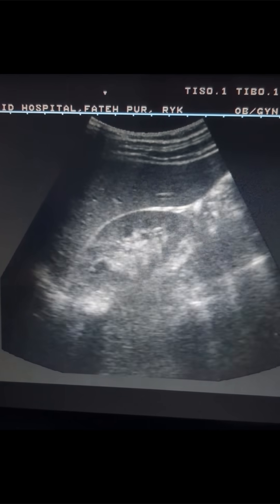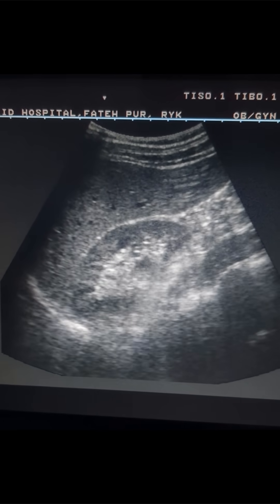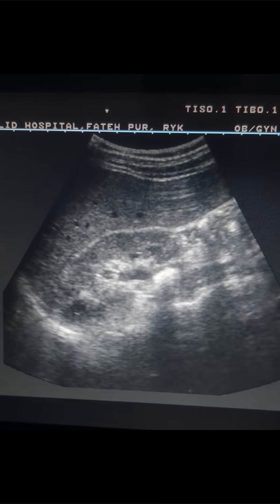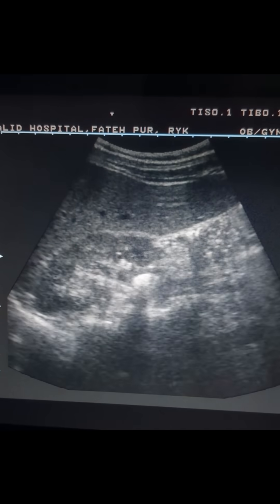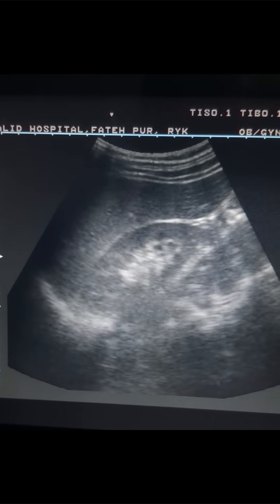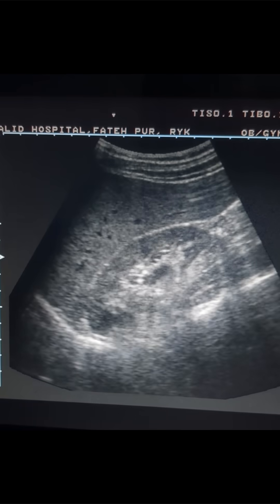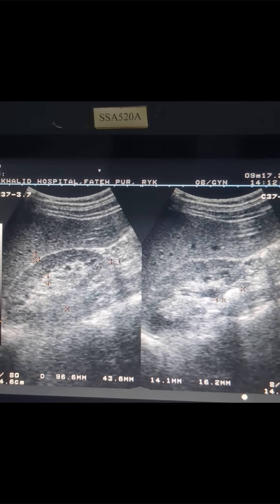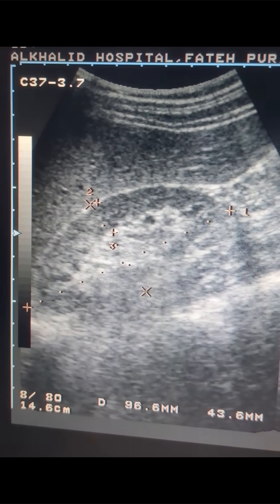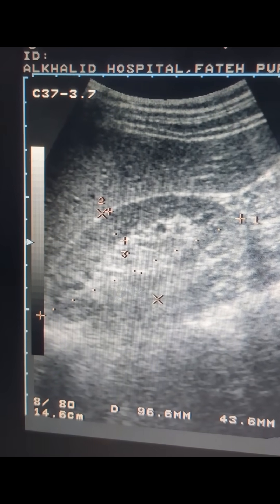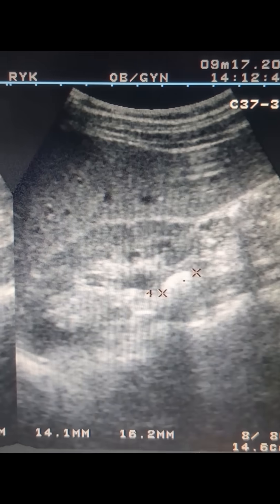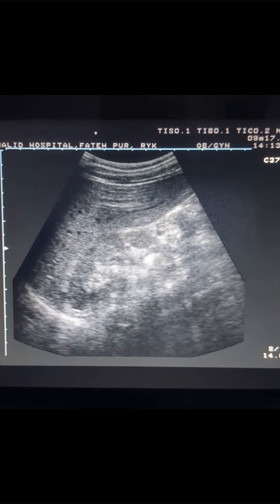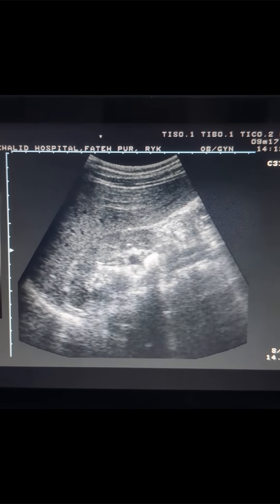This video is all about kidney stones. This is the right kidney with hydronephrosis — the pelvis is dilated and a stone is also seen in the pelvis at the ureteric junction, also known as PUJ. No stone is seen in the upper, mid, or lower pole of the kidney. The stone is in the PUJ. This is the kidney measurement, and the stone measures 1.6 centimeters, causing mild hydronephrosis.